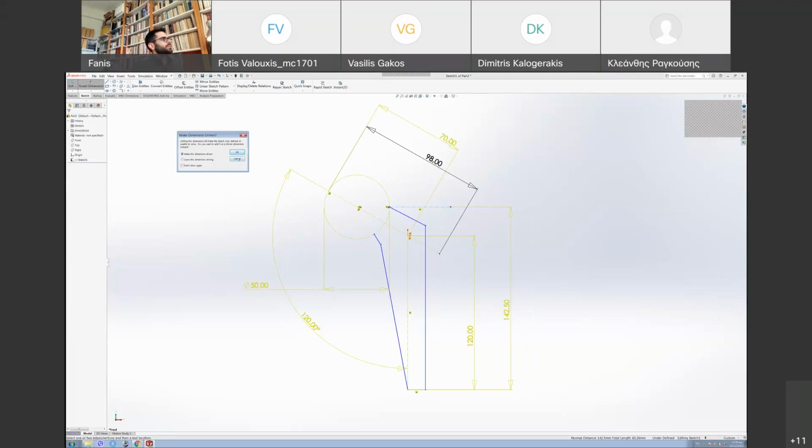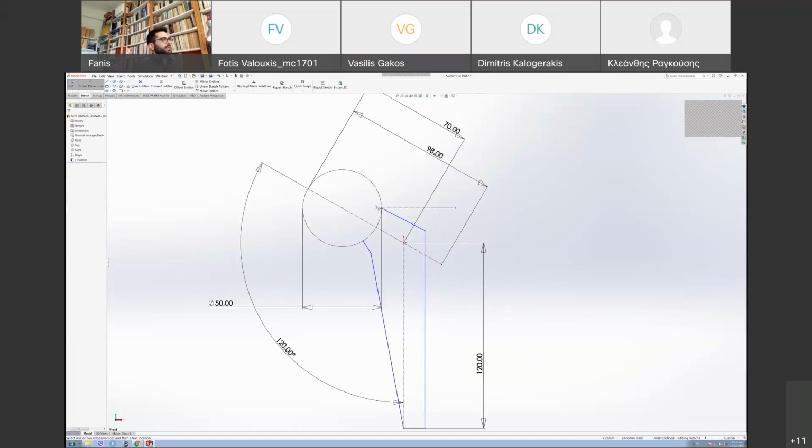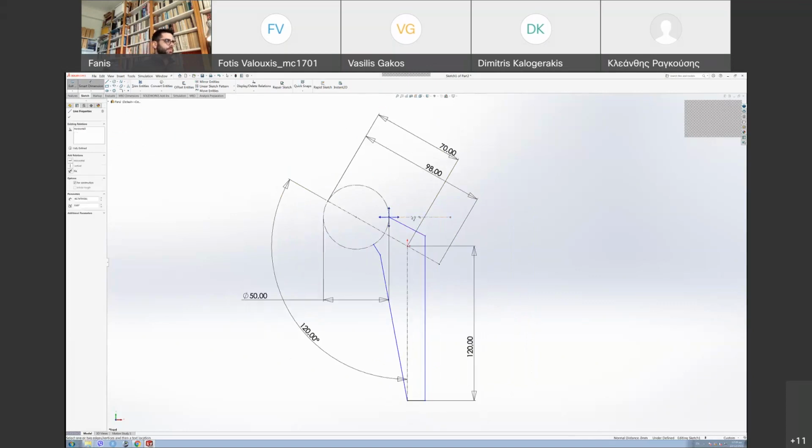Oh, sorry. Now, for example, okay, that's my bad, guys. Sorry, I just aligned this with this. Yeah, I made it coincident, and that's a mistake. Sorry.